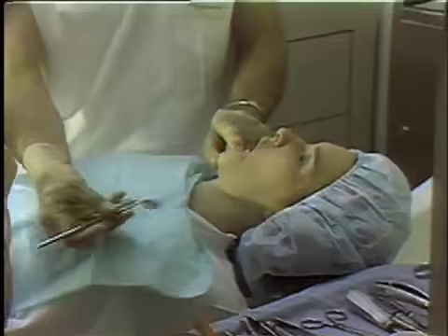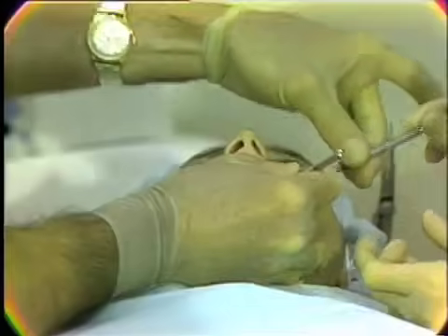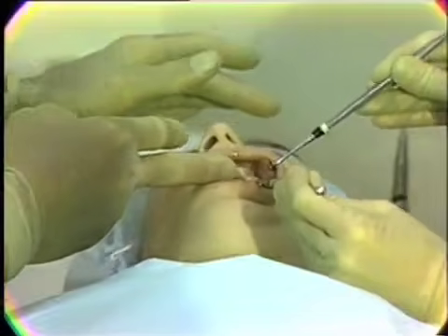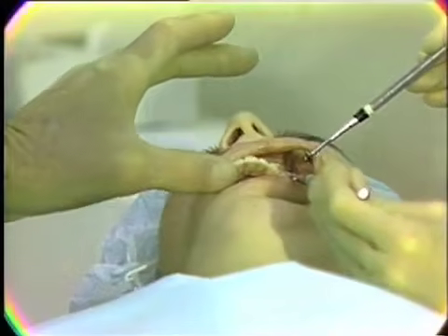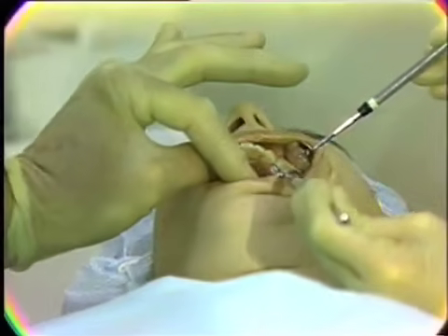That will keep the buccinator somewhat relaxed, and we then can retract laterally. She'll take that, and we'll also be able to retract in this manner. And if the patient again is instructed to keep turned toward the operator and not to follow the force of the traction of the retractors of the cheek, then we'll keep the field in view.